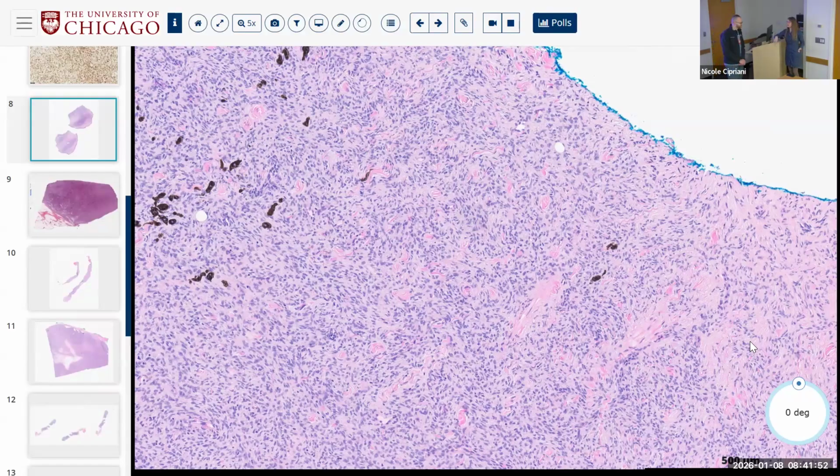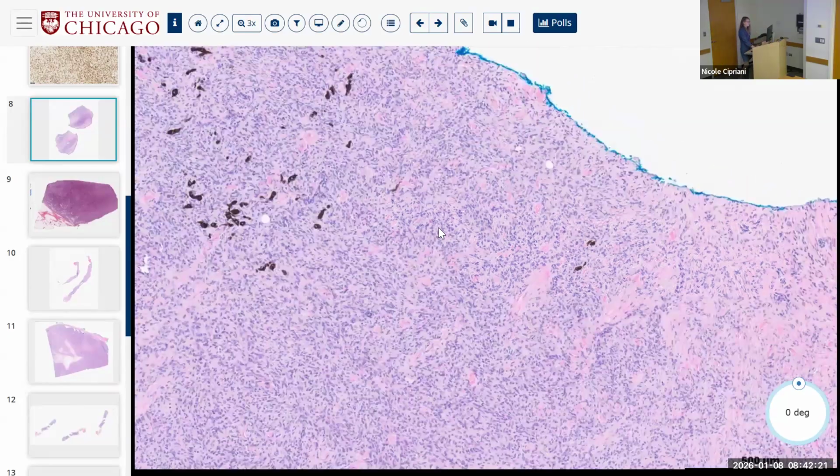So what about the first thought that you have, which is fibromatosis? What about this is different from fibromatosis conventionally? Not really the long sweeping fascicles, more like a storiform pattern. Yes, right. So fibromatosis has more long fascicles, more pink, arguably somewhat less cellular because there are fewer cells and they have more cytoplasm. They have long fascicles, so not quite what we're thinking, but fine. SMA, beta-catenin, you can think about it.